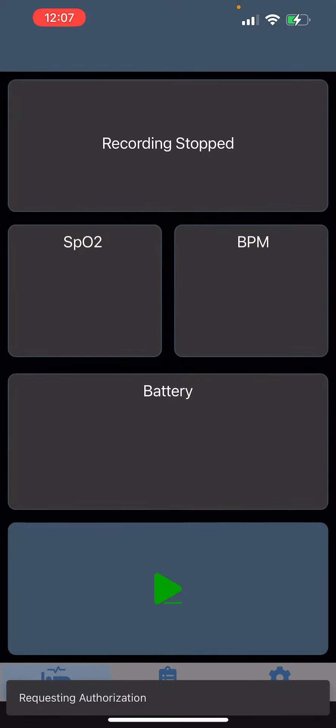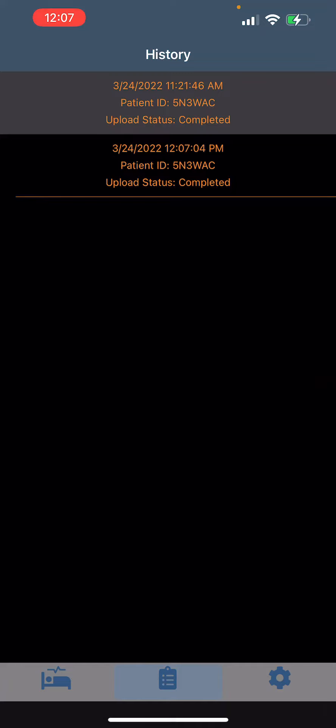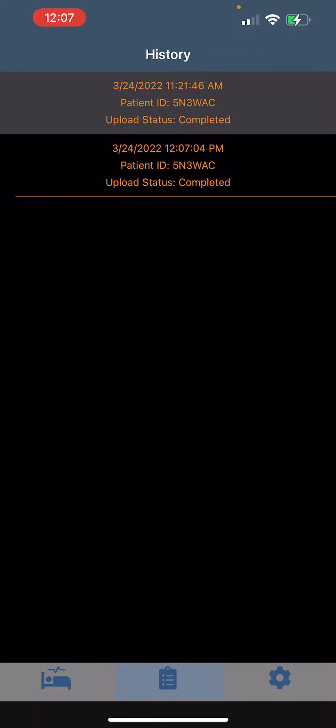At the very bottom, you're going to go to that middle section and it's going to show you your patient ID number, the time that you started and ended, and then it's going to show upload status completed. Make sure it shows completed.